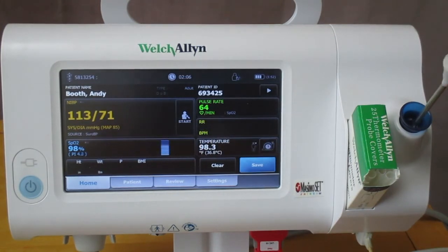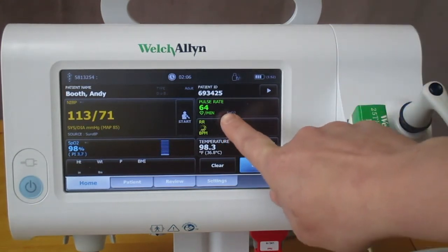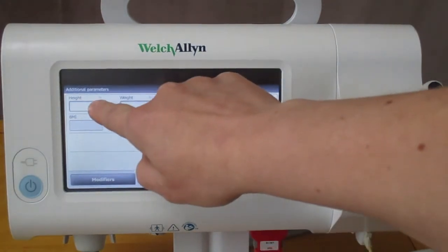All right, you can see here that respiration rate is still trying to acquire. So we're going to move over to the additional parameters that your facility may require.